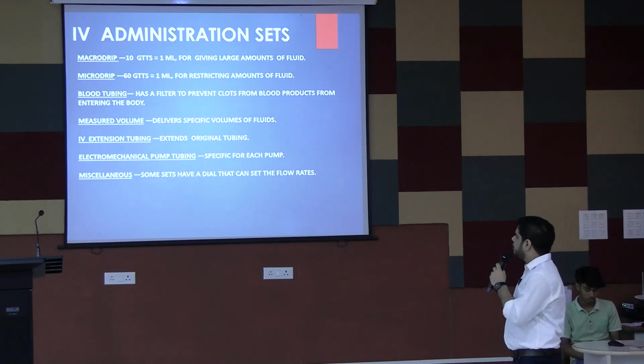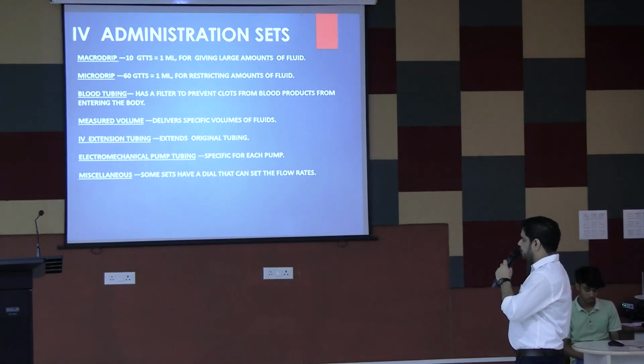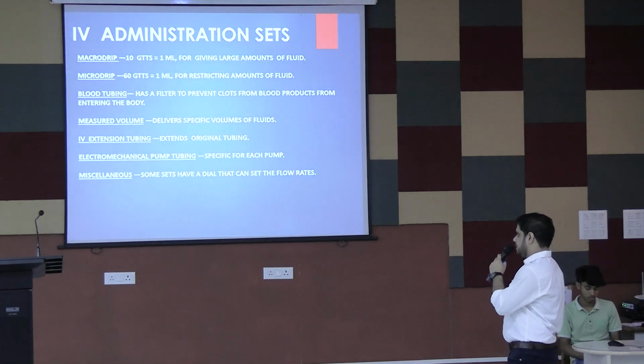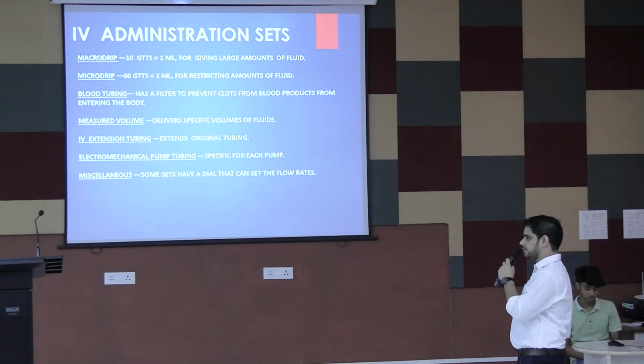Measured volume delivers specific volumes of fluids. IV extension tubing extends original tubing. Electromechanical pump tubing is specific for each pump. Miscellaneous: some sets have a dial that can set the flow rates.